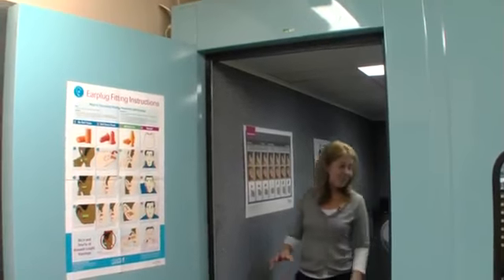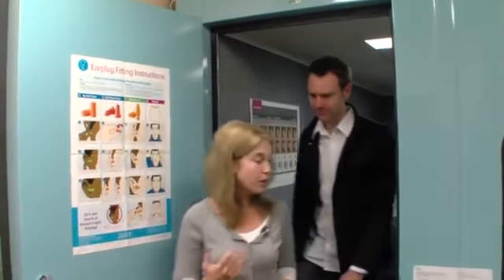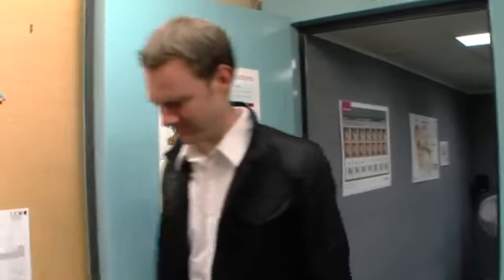Looking at these low into the mid pitches here, your hearing's looking absolutely fine. What's happening is as we get into these higher pitches, it's sloping off down to a more mild through to a moderate hearing loss, just at the very highest pitch there. A formal report is usually prepared and sent to the client, as well as to other relevant health professionals. What I'll do is write out a full letter with a copy of the results and send them out to you in the mail. Right.